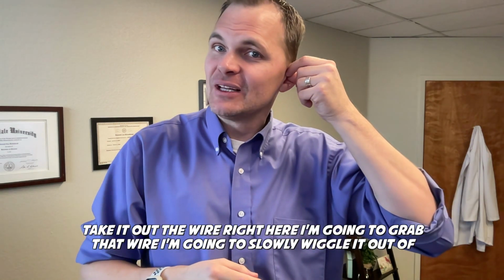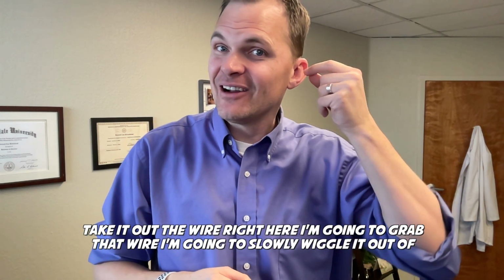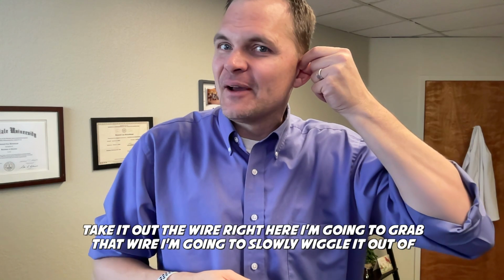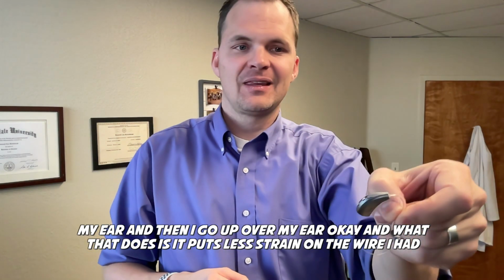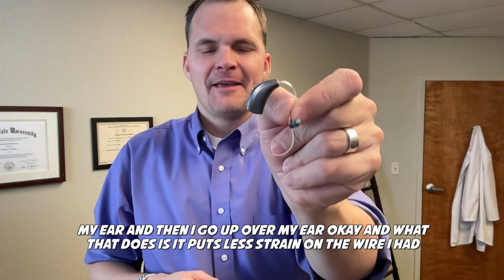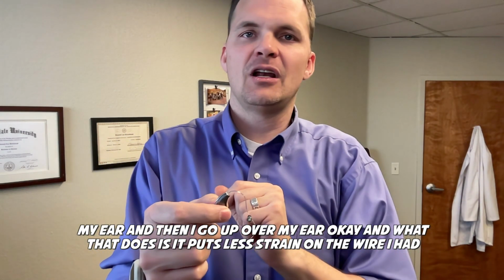So let me show you really quick how to take it out. The wire right here, I'm going to grab that wire, slowly wiggle it out of my ear, and then go up over my ear. And what that does is it puts less strain on the wire.